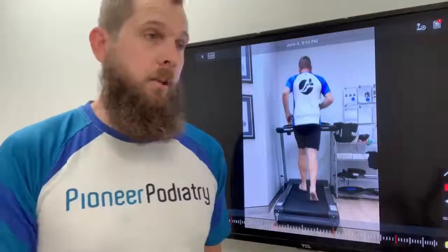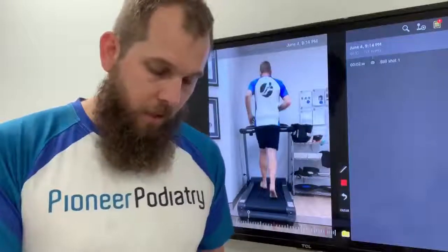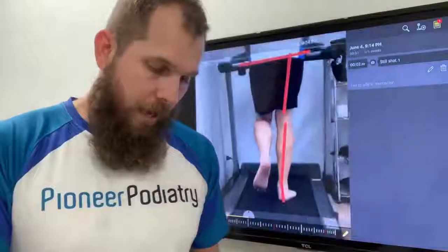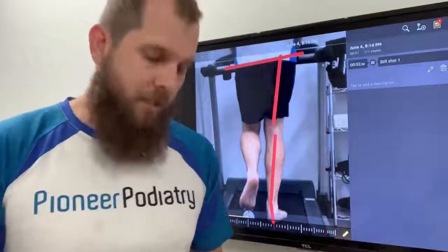So we are generally working hand in hand with our local physios, chiropractors, surgeons, other sports physicians, whoever's helping that patient. We're usually involved as a team. What you can see here is it allows us to pause and analyze which parts of the body are moving in different ways at different times.